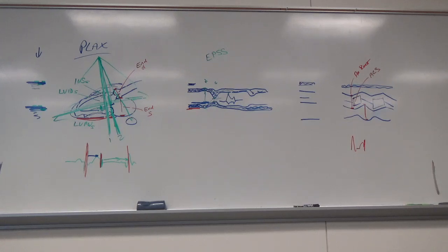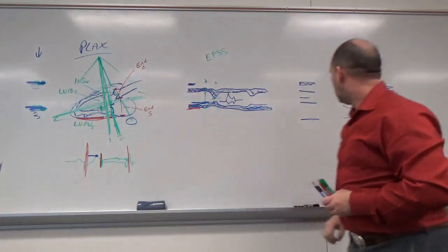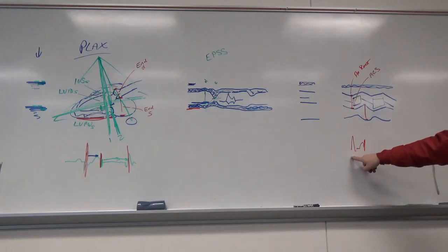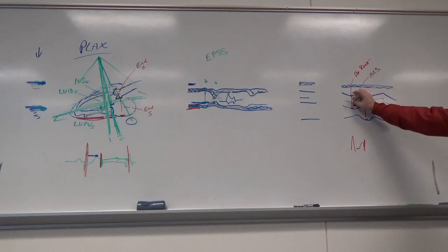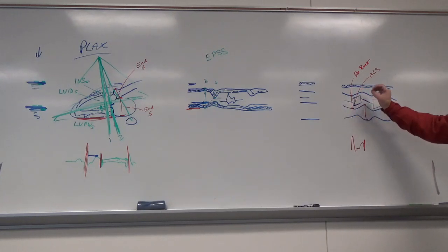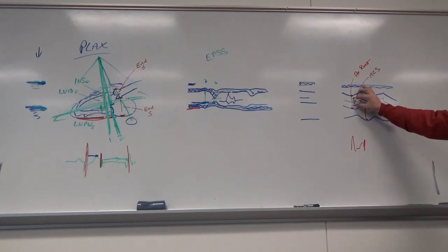Can you just real quick go over what those were one more time? So this is aortic root. That's this moving up and down. You measure it at its lowest point, which is going to line up with the R wave of the QRS. Then my aortic cusps are together here. This is where they're closed. And then in early systole, when the box opens, this is the only one that we really measure in early systole. You don't want to do the end, because the biggest volume going through the aortic valve is early. So you measure that right at the beginning of that box. You're looking at the cusp separation on that.